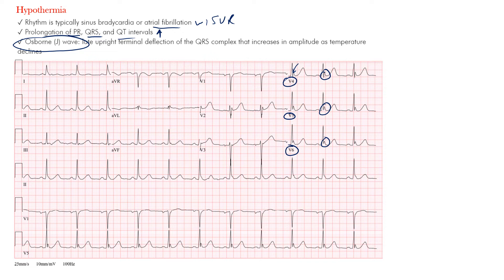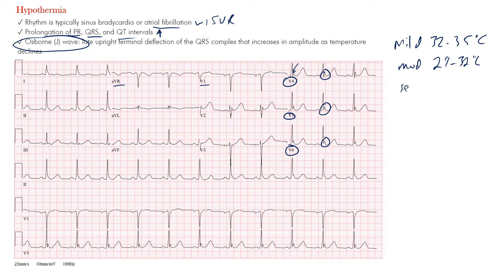Remember, it may be negative in AVR or V1, but otherwise it will be positive in the other leads. So this is hypothermia. The degree of how high those J waves get is based on how low the temperature gets. Mild hypothermia is between 32 and 35 degrees Celsius, moderate is between 29 and 32 degrees Celsius, and severe is less than 29 degrees Celsius. As the patient gets colder, you'll see an increase in J wave or Osborne wave amplitude. If a patient's temperature is around 36 degrees Celsius, you may not see this wave at all.